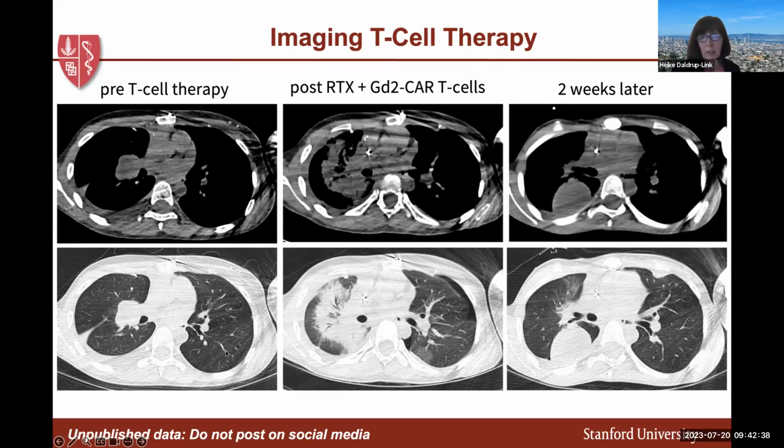If you look on the contralateral lung, initially there were no tumor nodules there that we saw before the start of this therapy. And then we started to see these ground glass opacities here. And these are very transient. We saw them in other parts of the lung as well. You see 2 weeks later, they are gone. And this is something that we see in regular intervals in our patients. These patients get these transient ground glass opacities, and we do not know what they are exactly.